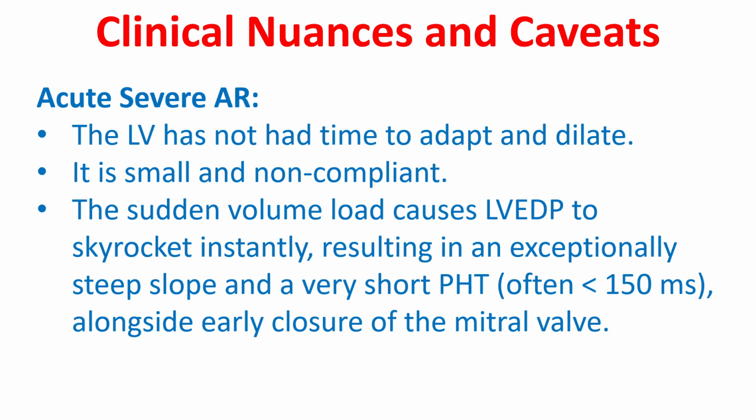It is small and non-compliant. The sudden volume load causes LV EDP to skyrocket instantly, resulting in an exceptionally steep slope and a very short PHT, often less than 150 milliseconds, alongside early closure of the mitral valve, or pre-closure.